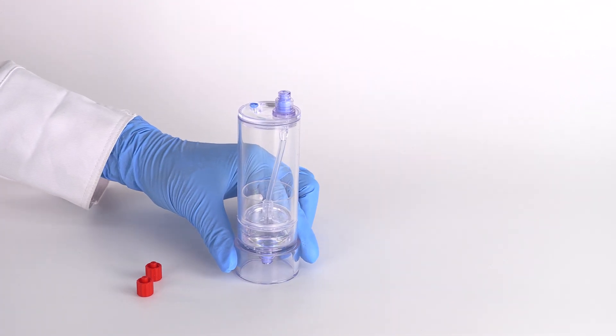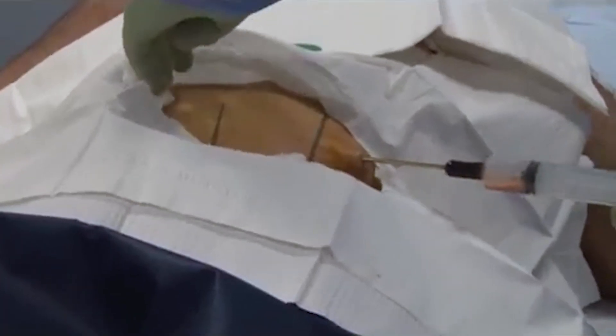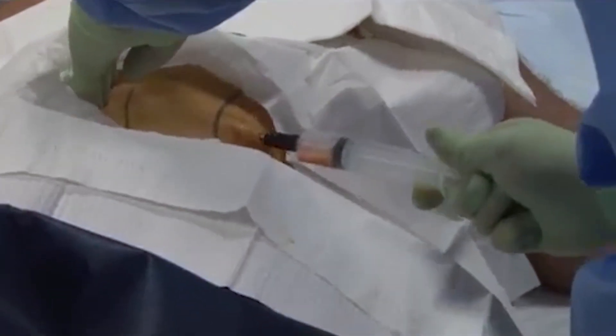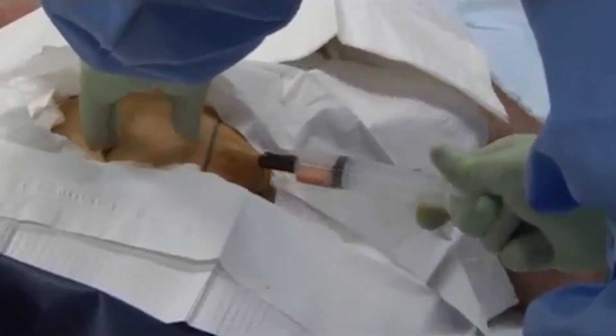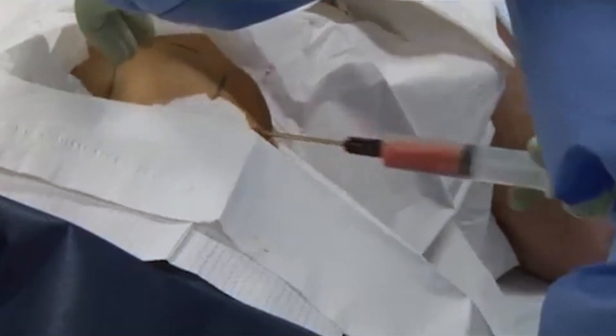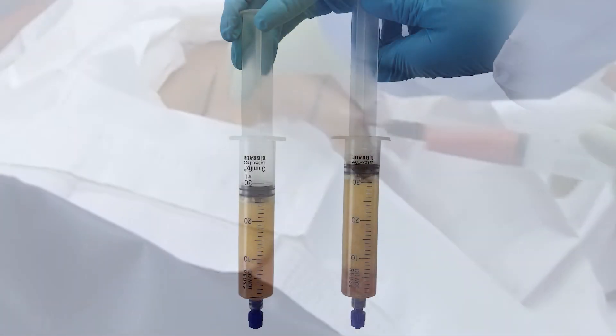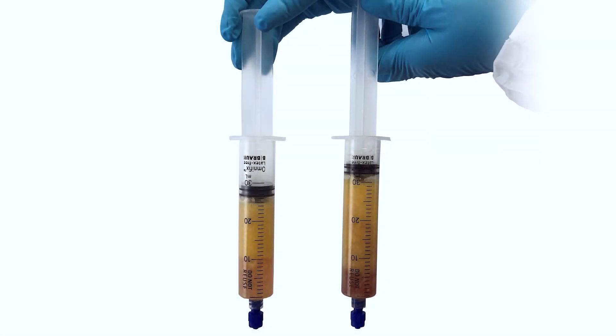Be sure to collect the adipose tissue according to the technique described in the IFU or according to the protocols established by the facility. It is recommended to collect enough adipose tissue to ensure that the desired amount of concentrated adipose is attained after processing.